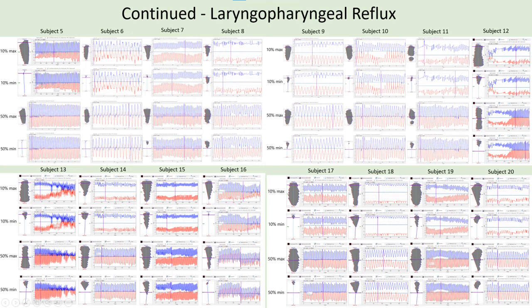The trajectories can be extracted, but they are in a proprietary format that can only be decrypted by the developers at Erlangen University Hospital, whom it is possible to contact for information.